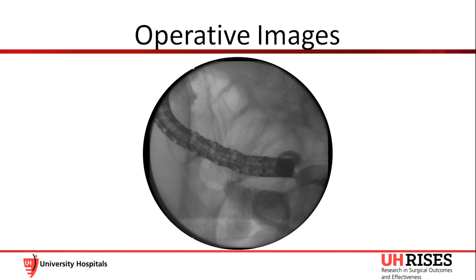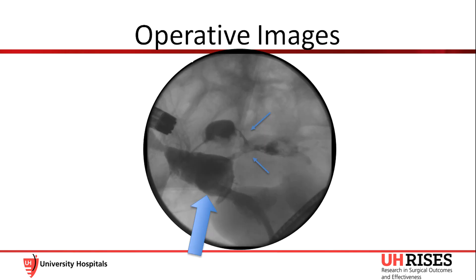We then turned our attention to the colocutaneous fistula and used a colonoscope to advance the scope through the stoma until we reached the cecum. We were unable to definitively identify the colonic fistula, so contrast was injected through the IR drain. This demonstrated a serpiginous tract to the base of the cecum that was remote from the ileocecal valve. The fistula tract is seen here identified by the small arrows filling the cecum, as well as the cavity, which is identified by the large arrow.